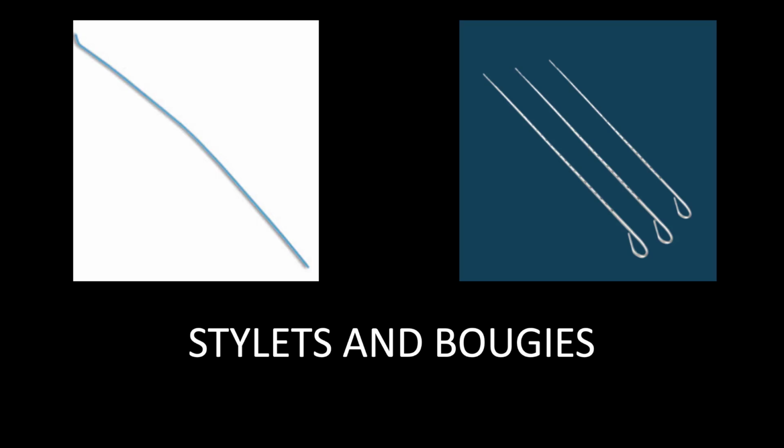Many of you know that I am a big proponent of the bougie, and this is standard of care in many other countries in the world that I've worked in. And I've now made the bougie my standard equipment for every first intubation attempt that I do. Generally, these bougies are very long devices, anywhere from around 50 to 60 centimeters. They're narrow at about 5 millimeters, and they have a small 40-degree coude tip at the end.